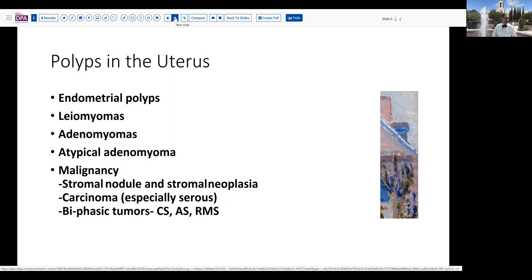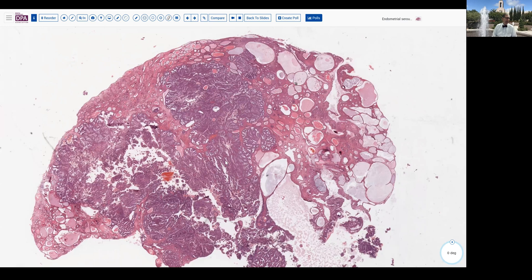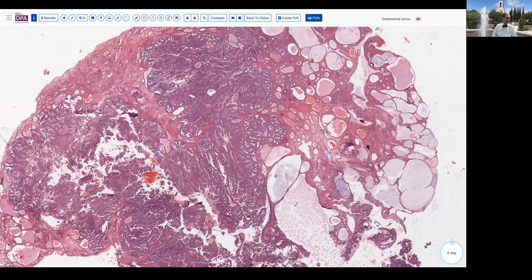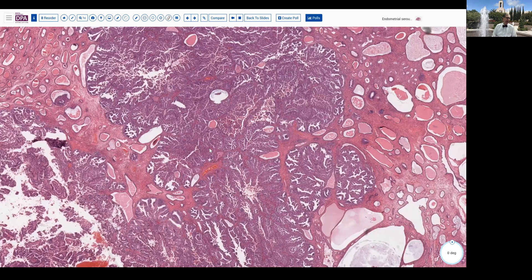In this case, the polyp was examined and found to have some features that looked like a typical endometrial polyp with dilated, inactive glands amidst a fibrous stroma. But mixed with that, you can see geographic areas of increased cellularity and more nuclear material forming a more purplish color. At low power, note how we can appreciate slit-like spaces in this lesion and irregularly shaped glands, in contrast to normal endometrioid glands, which tend to be more rounded or oval. That should be a clue, even at this low magnification, that we may not be dealing with typical garden-variety endometrial carcinoma.